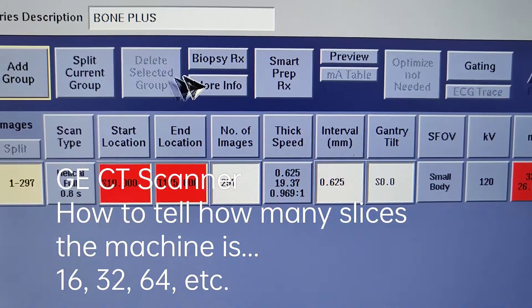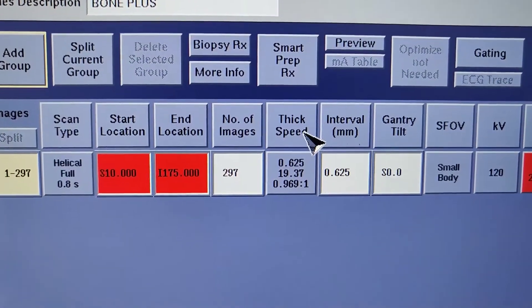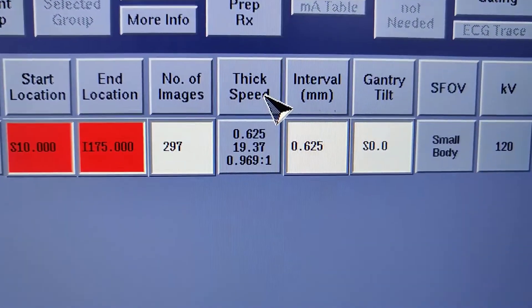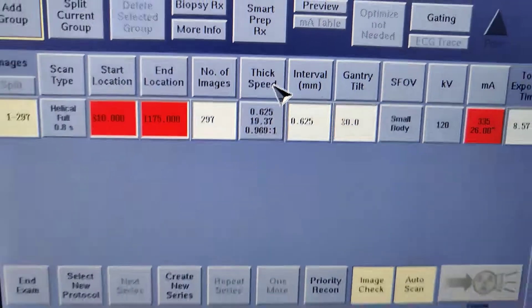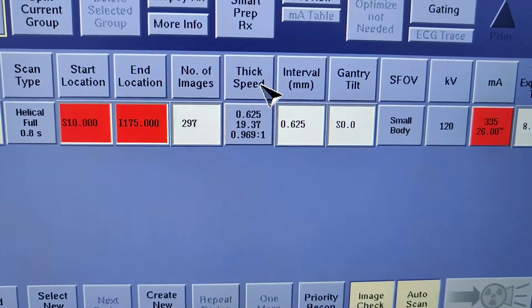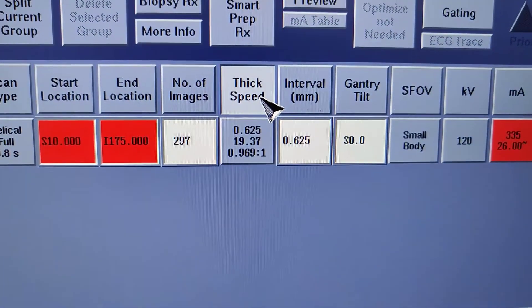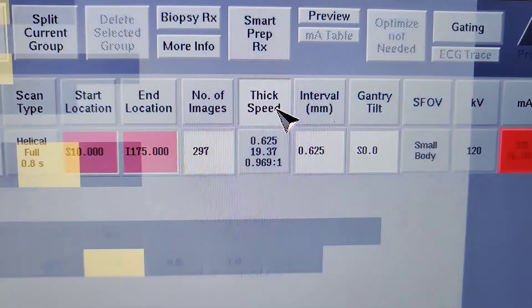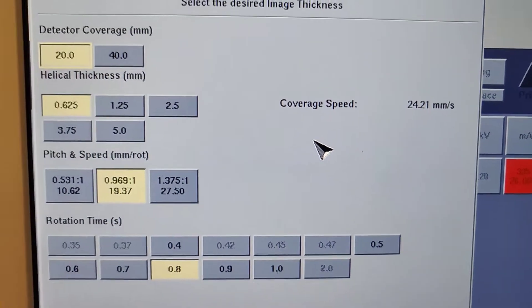If you want to know what your slice thickness is for your machine, go into one of the protocols, click thick speed.